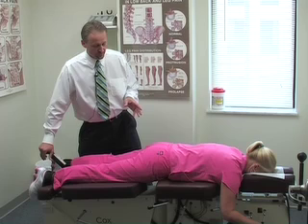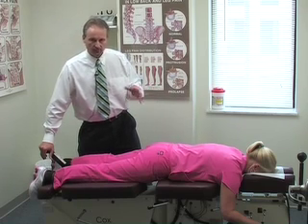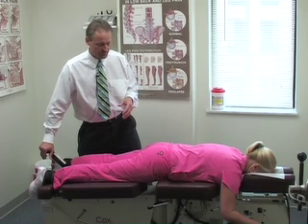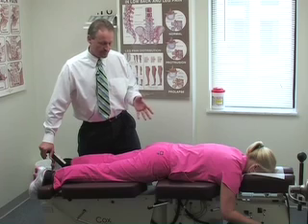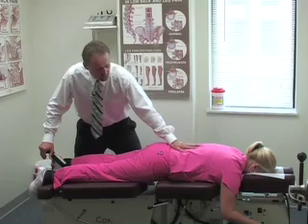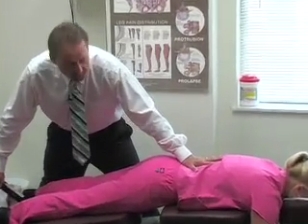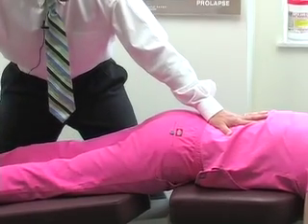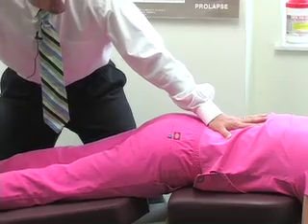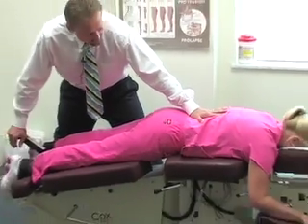Also, it has the added benefit of being effective for facet syndrome type of patients or biomechanical low back pain patients. Whereas your typical physical therapy extension exercises will actually jam those facets together. This treatment, as we apply the flexion to the involved motor unit, it opens those facet joints up, relieving the source of the pain, also returning motion to a segment that has become dysfunctional and improving the alignment.